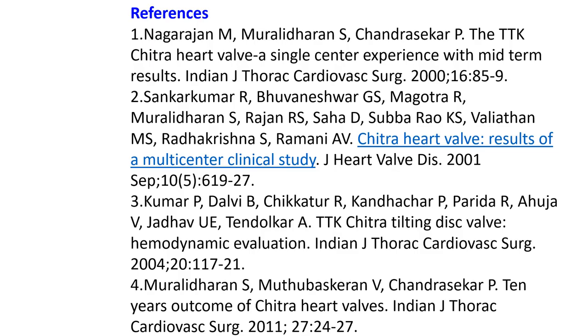This X-ray image is that of a TTK Chitra heart valve. Several studies have been published on the use of this valve. 10-year outcomes have been published by Muralitharan S. and colleagues in 2011.